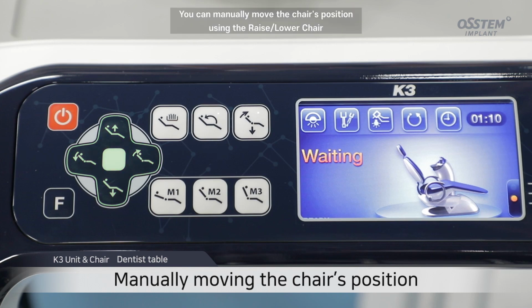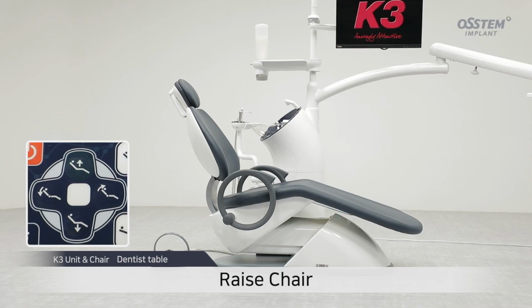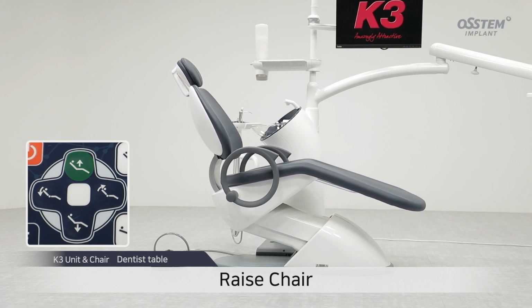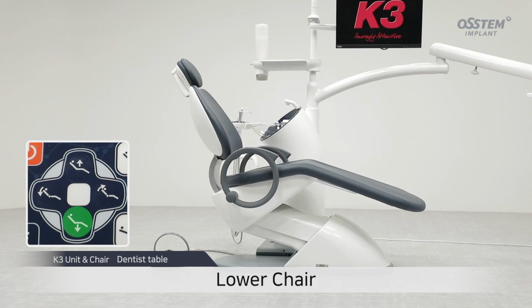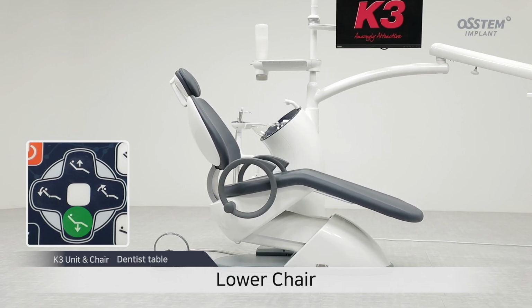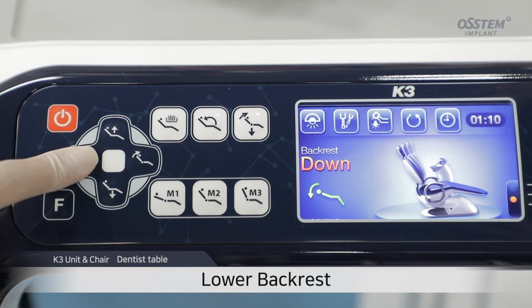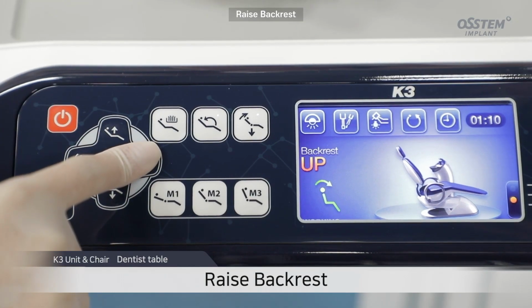You can manually move the chair's position using the raise lower chair or raise lower backrest buttons on the dentist table. Raise chair. Lower chair. Lower backrest. Raise backrest.